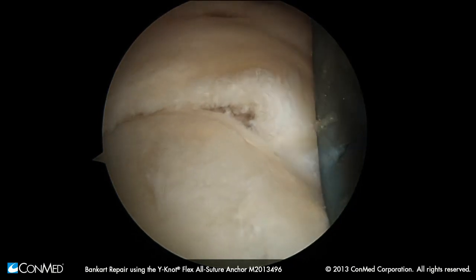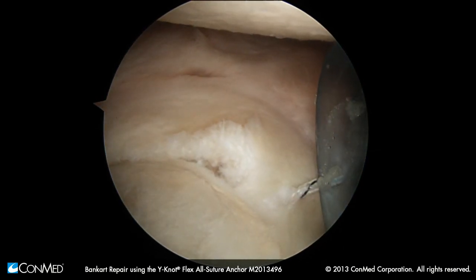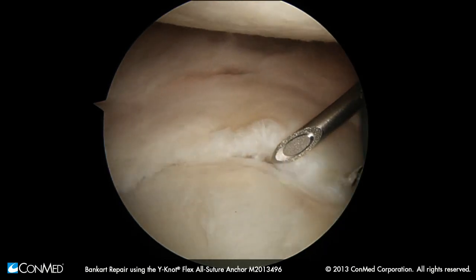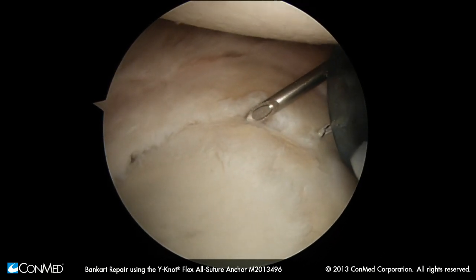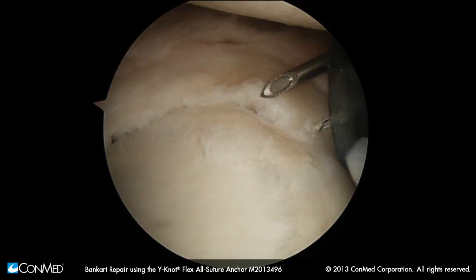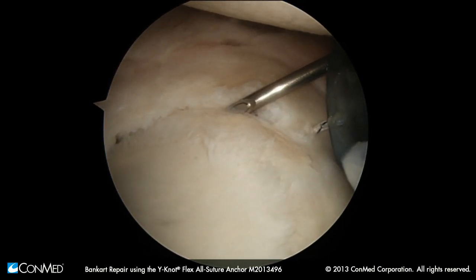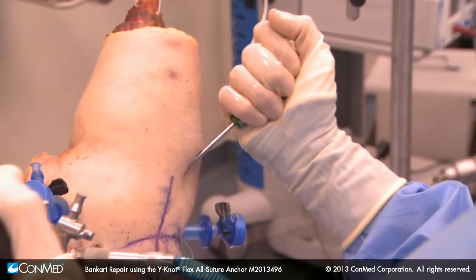Our seven o'clock portal is about four centimeters down from the posterior lateral corner of the acromion. Anywhere in here is pretty safe. That is a more reasonable angle that you can use to put an anchor right here if you need to. It's a small percutaneous approach — you don't put a cannula through here. We'll just make a tiny little skin stab and use a flexible inserter through our seven o'clock portal.